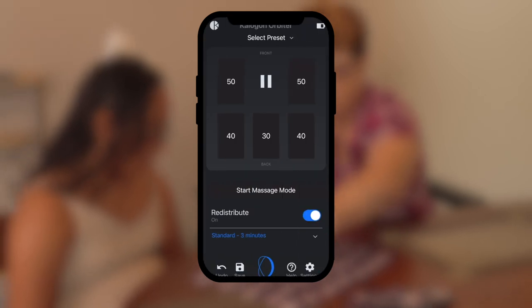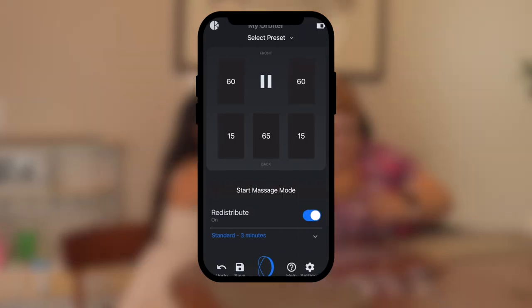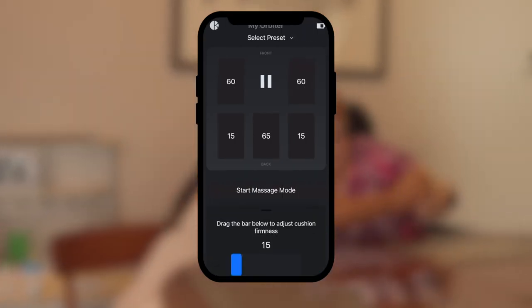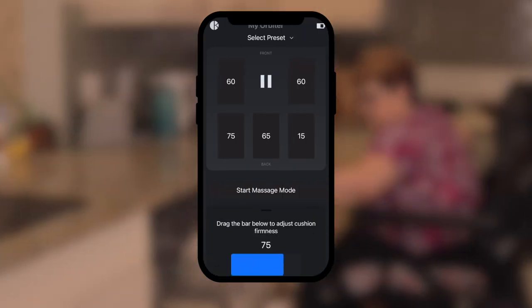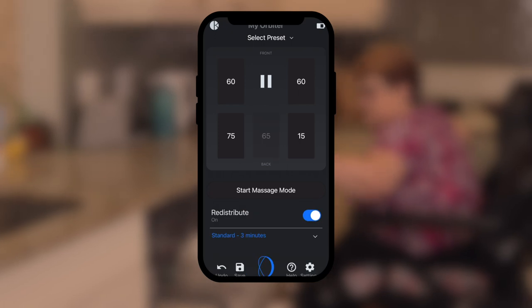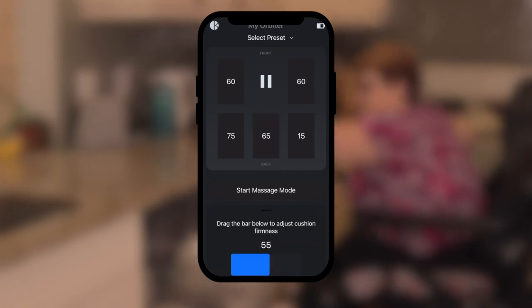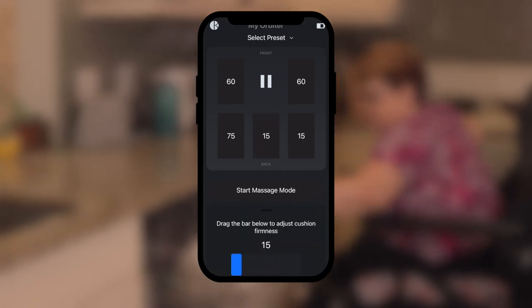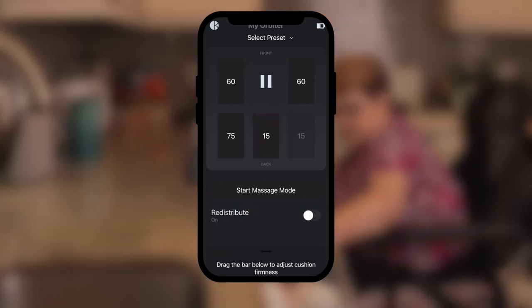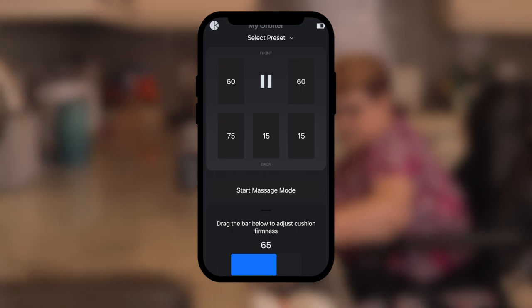You will then be prompted to choose your setting by tapping on each space that represents each bladder in your new Orbiter. Adjust each bladder by sliding side to side the bar at the bottom of the screen.